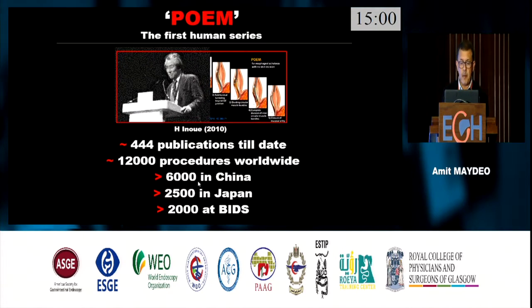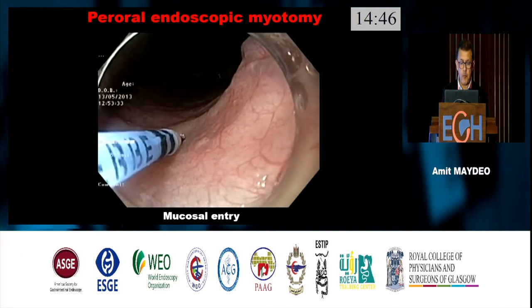And from the time it has been invented, there have been more than 400 publications on POEM. 12,000 procedures of POEM performed in the world, 6,000 in China, 2,500 in Japan, 2,000 in our own department in Mumbai. And you see here, this is what we do.